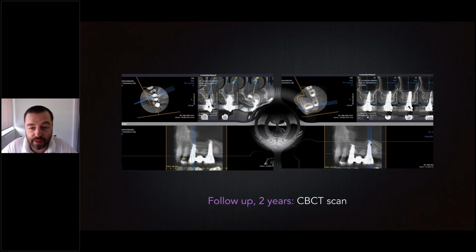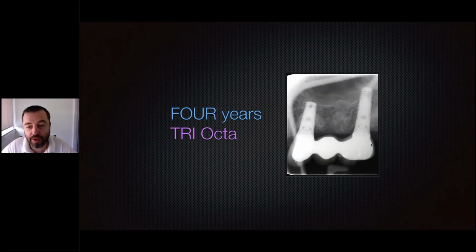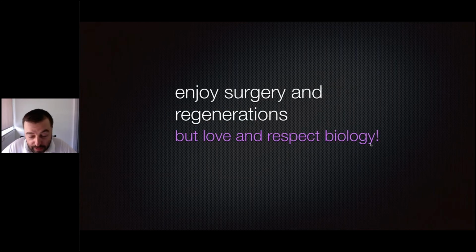So this is the X-ray of 3 years and 4 years. It looks very nice and stable. But we need to enjoy this type of surgeries and regenerations, but all the time we need to think about the patients.